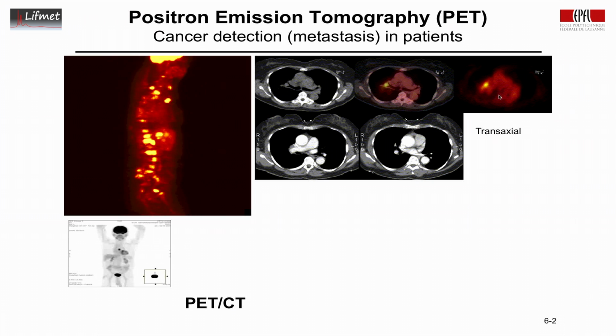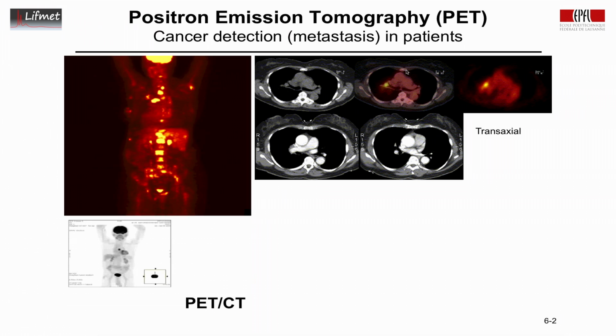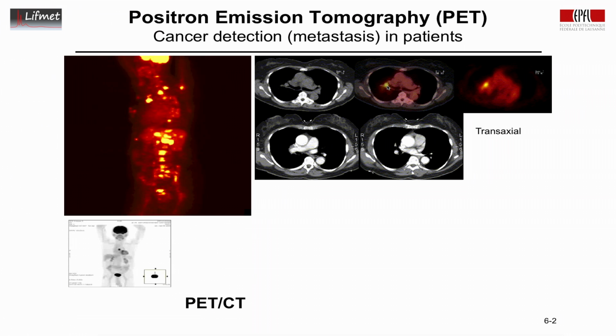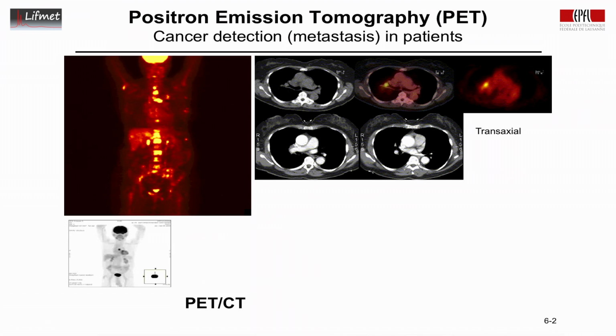And here we see in the PET scan, we see uptake here in this spot. This is not very informative to figure out what is actually going on and where, but if it's overlaid on the grayscale image, so we'll take this image here, and they are all fused, color-coded the PET data, one can see very clearly where this bright spot of uptake is in the body.